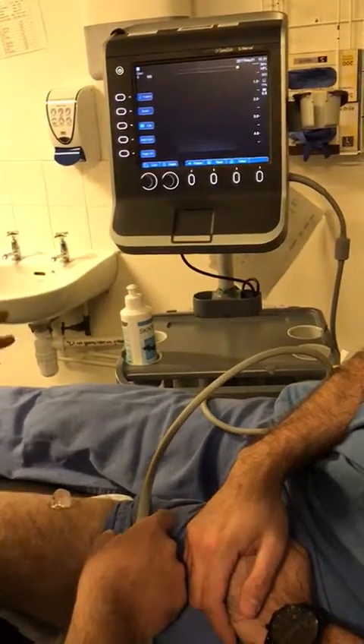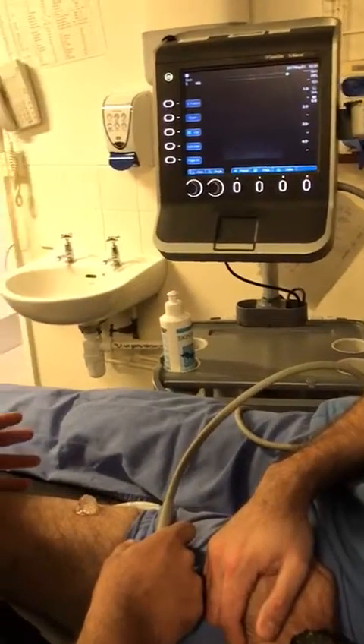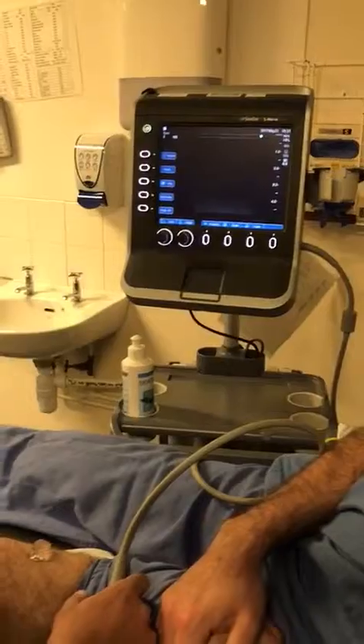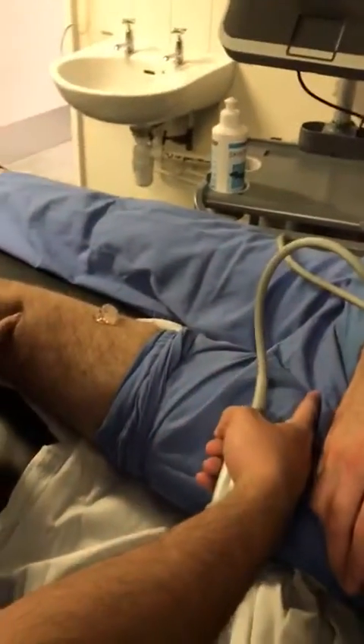You're going to do the so-called adductor canal block. I would call this a low femoral triangle block at the mid-thigh level. The landmark would be the top of the patella and also at the mid-thigh level.